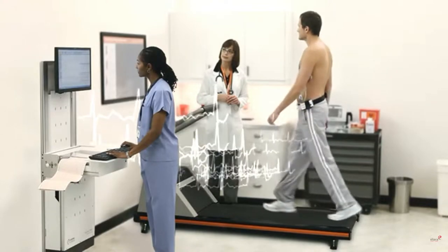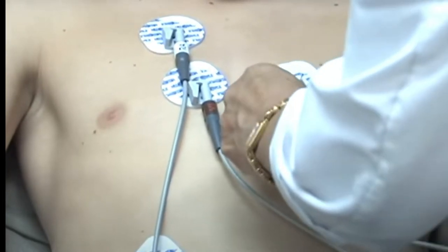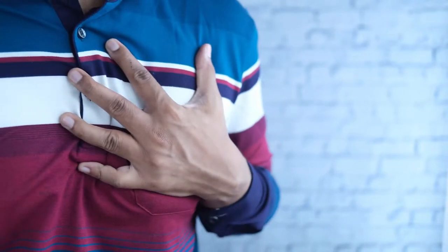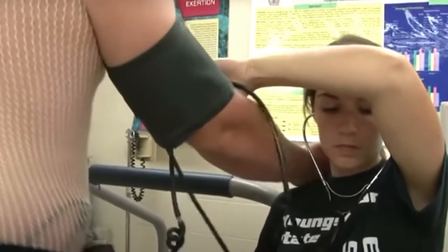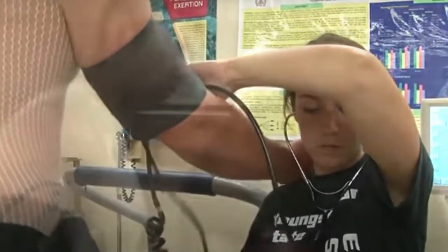The treadmill test is considered positive when the patient has significant ECG changes compared to baseline. Changes are considered significant if multiple leads show them, especially lead V5, which is considered the most significant lead. If the patient has chest pain while walking, sustained arrhythmia, or if the BP is falling while walking — normally BP should rise during exercise — these are the findings that make a treadmill test positive.